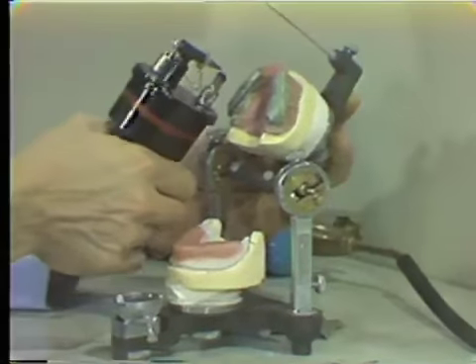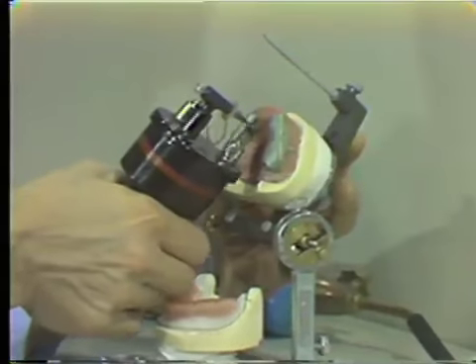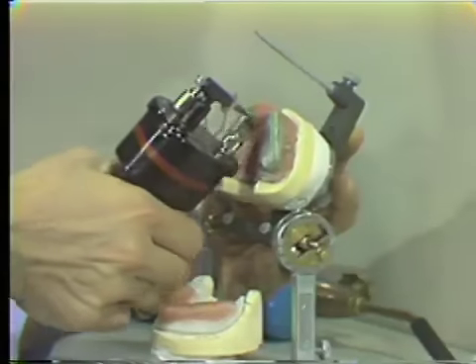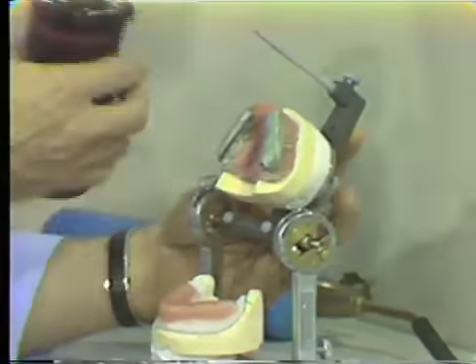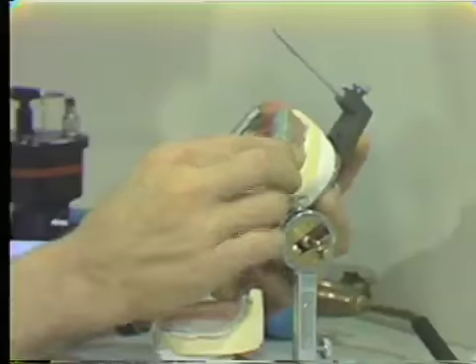At this point, it isn't extremely important that patient close all the way. But what is important is that he protrude his mandible so that we can get a registration of the two positions, one in the forward protruded position and the other in the centric position.